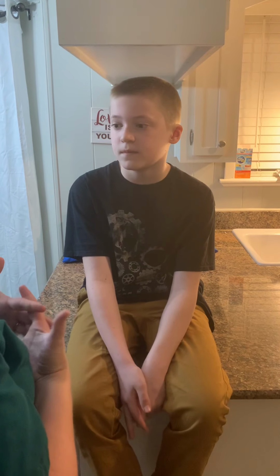So we're going to listen to several different parts of your heart, and we're going to listen on both sides of my stethoscope just to see the different sounds. Doesn't mean anything's wrong. We just want to make sure our assessment is very thorough, okay? Do you have any questions for me before we get started?